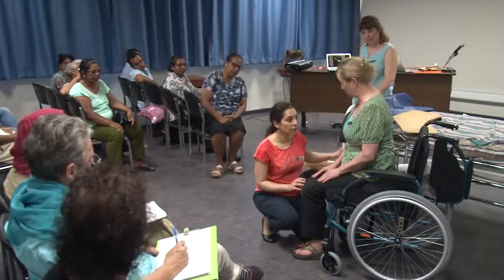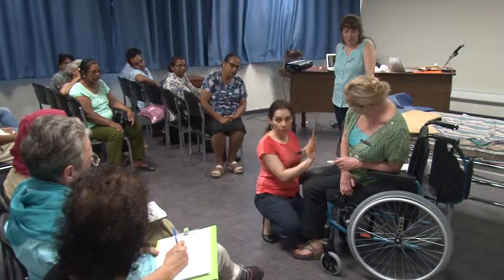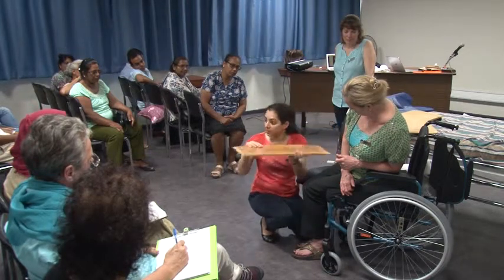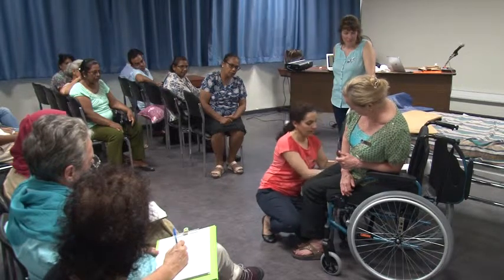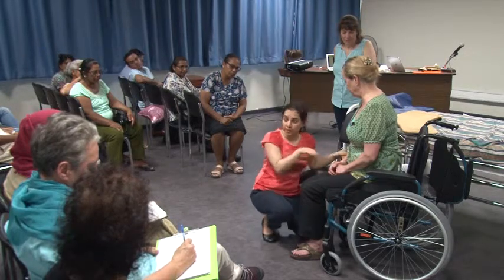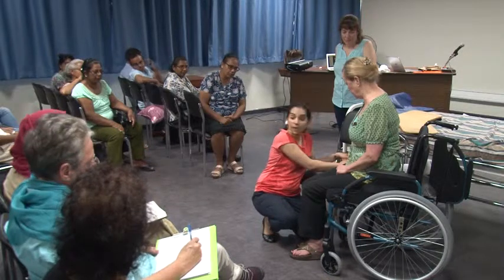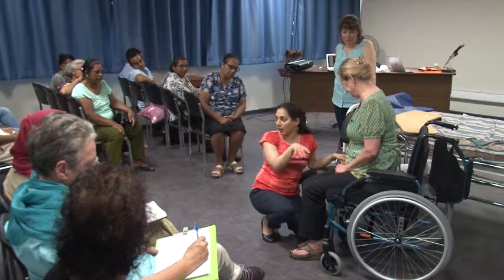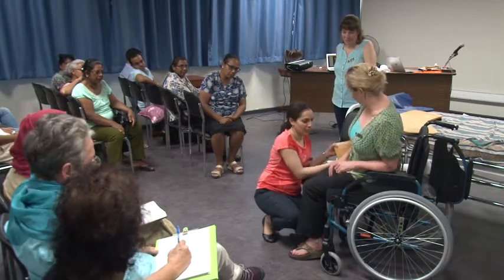So I'm going to ask Fiona to lean to the left side there, and I will take the board facing downwards, not like that because you will be hitting the skin. Facing downwards and under, and then back. Now just to make sure that the slide board is right under them, the little tip is I ask the person to place his or her hand on the board and just put a little pressure. You see the seesaw effect? It is well under her now. And if it isn't, then just pretend that it isn't.